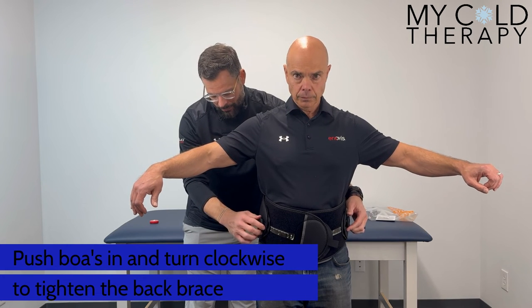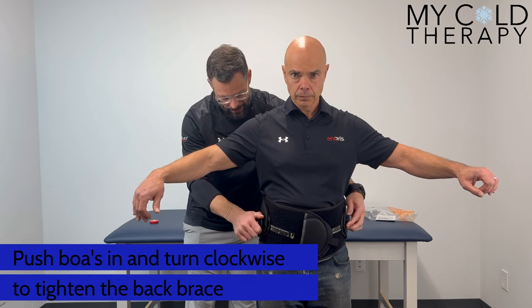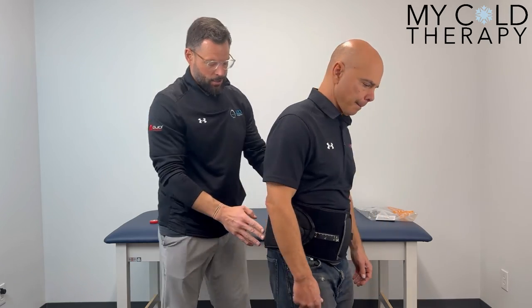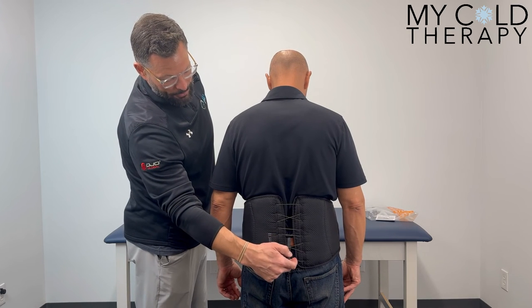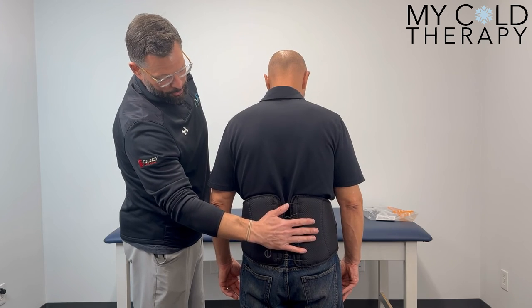Now we've got both boas — turn clockwise to tighten the brace. As you can see when Steve turns, we're now nice and tight in the back. We're sitting right at the top of the buttocks and the tailbone, supporting the lumbar spine.